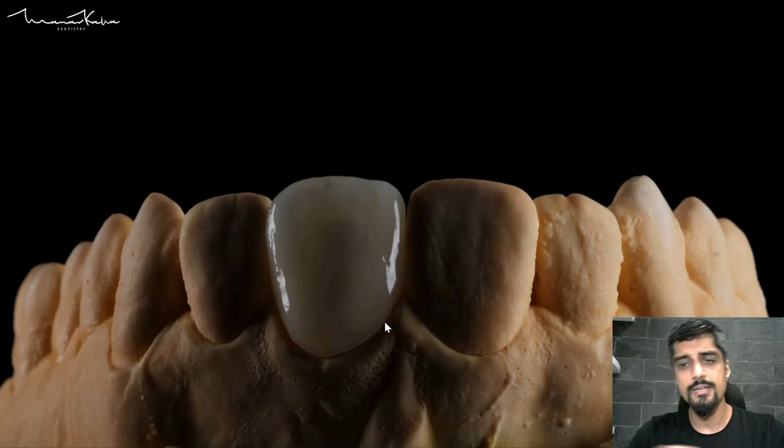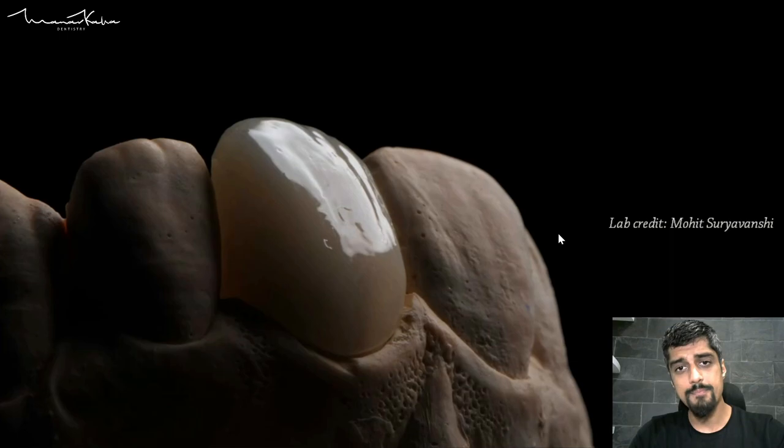Here is the restoration that has been fabricated, looking absolutely nice. You can see the translucent nature of the E-max restoration — you can see the tooth preparation underneath. Absolutely fabulous restorations provided by Mohit Suryavanshi. If you have a good ceramicist, you cannot do indirect dentistry unless and until you have complete confidence in your lab.